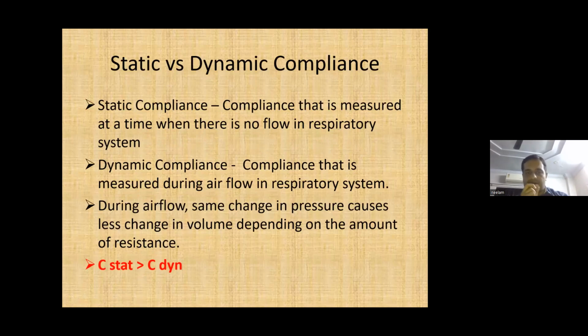Static compliance is actually the compliance which we measure when there is no flow of air in the respiratory system. Okay, so there is inspiration and then there is expiration. In between, if there is a pause, a phase where there is no gas flow, I measure the compliance at that time point. I measure how much volume has changed because of a certain pressure change, then it is called static compliance.